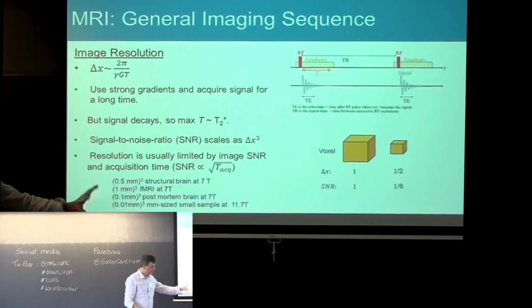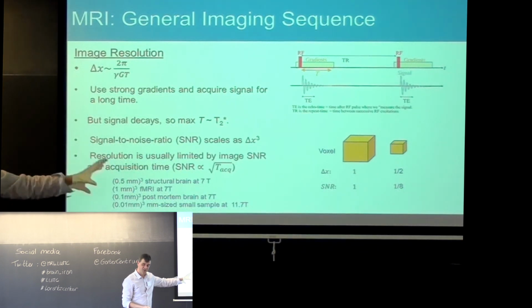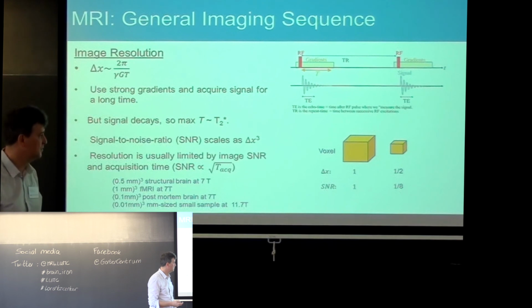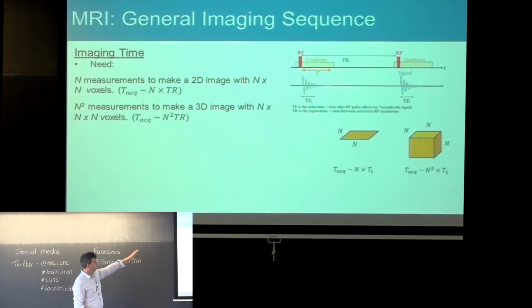So we're not going to be imaging individual ferritin, so it's not going to really happen unless we use other methods for detecting nuclear magnetic resonance. And there's some of those on the horizon, but they're not really going to probably be impacting on imaging live human systems, human people. Just a bit on the imaging time.